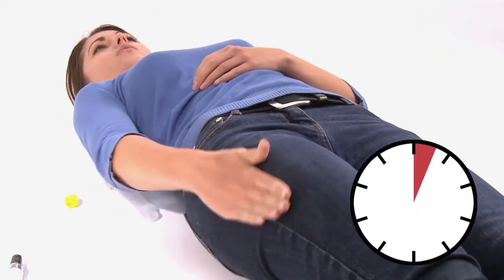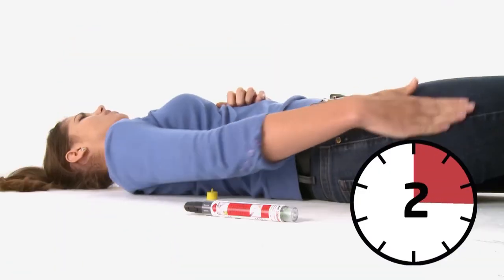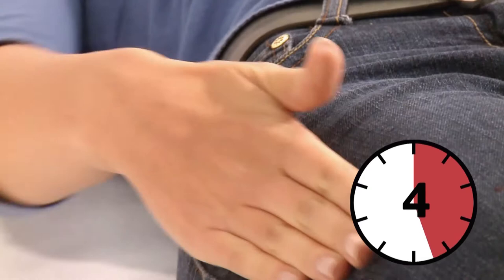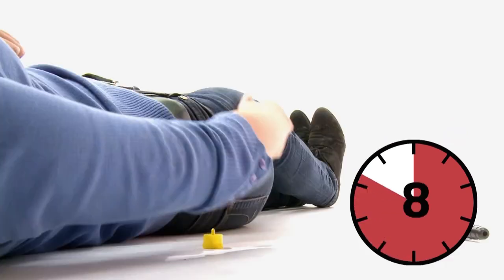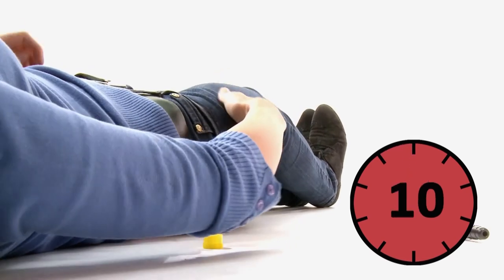Jext has been designed to inject through the clothes, avoiding zips and buttons. Massage the area for 10 seconds. The needle shield will automatically cover the needle when the Jext is removed from the thigh.